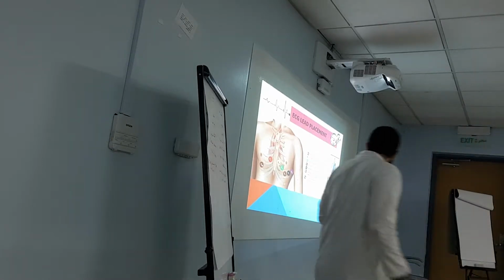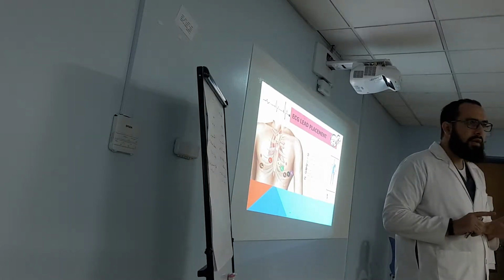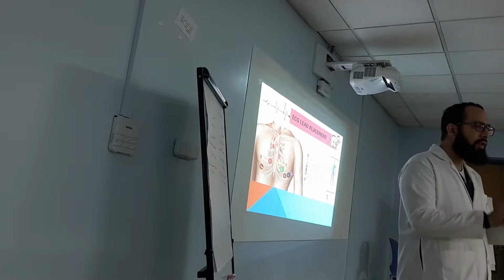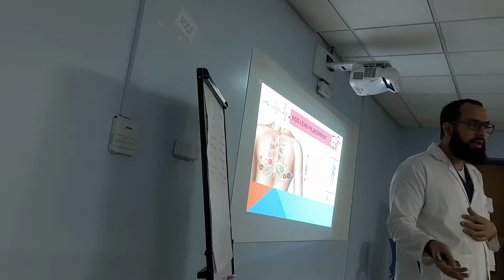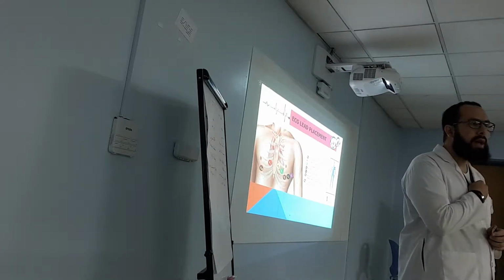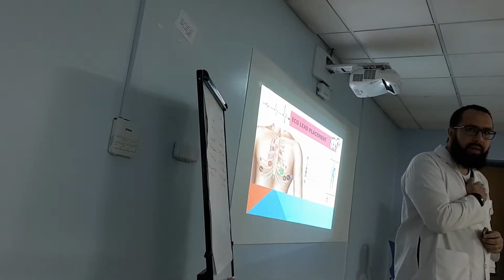If the patient has a burn, or a pacemaker, try to avoid this area. If they have an implanted device, or fresh wounds, try to avoid these areas. Otherwise it may not give a reading, or it may give artifact, or may cause pain for the patient. If the patient has a nicotine patch, nitroglycerin patch, or fentanyl patch, don't put the lead on top of anything.